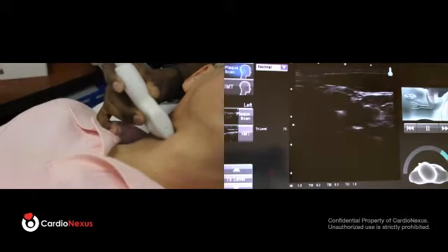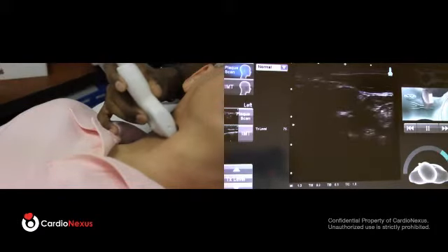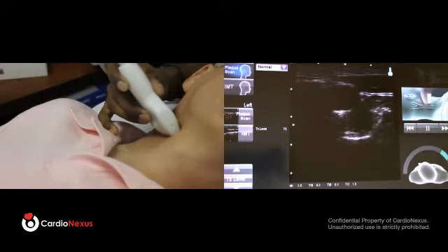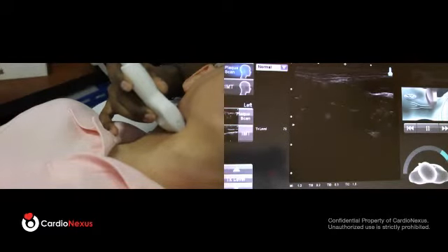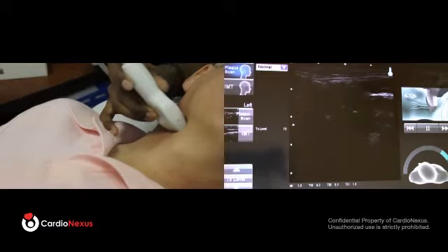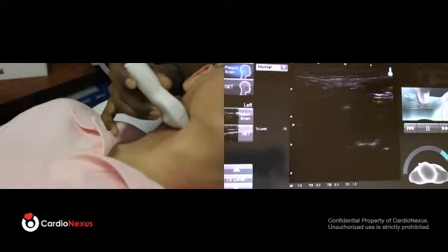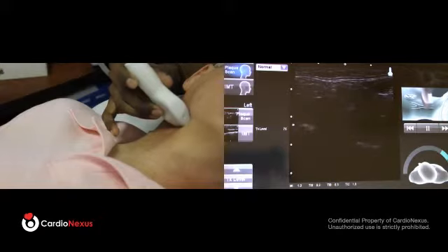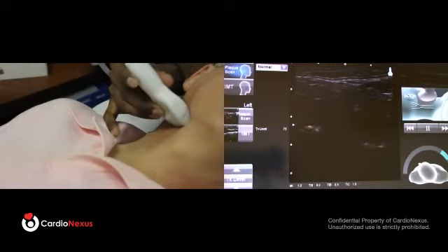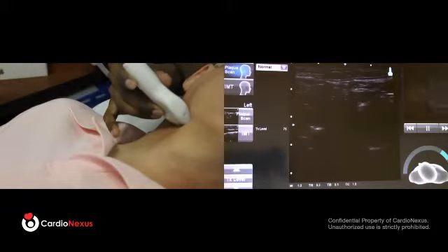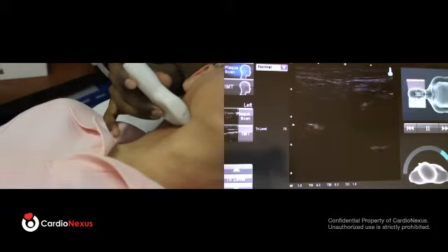As you're pulling the probe toward the patient's jaw, you'll see the artery start to expand. If you keep continuing, it will clearly split into the internal and external carotid. Continue sweeping up, looking for any lumen-obstructing or lumen-encroaching material, until you either lose the artery or run into the patient's jaw — in this case, we have.